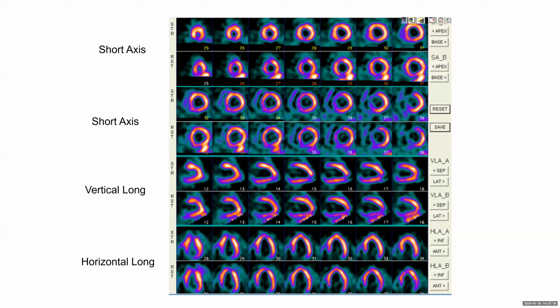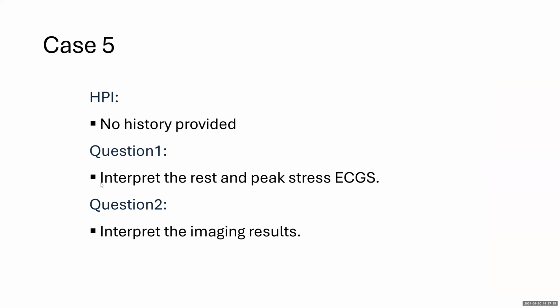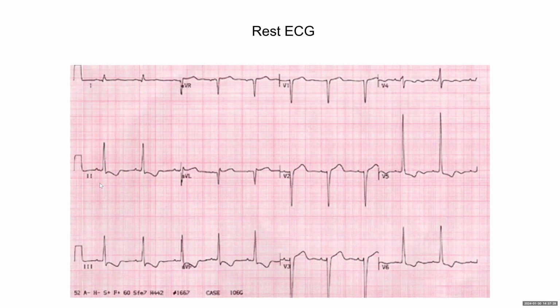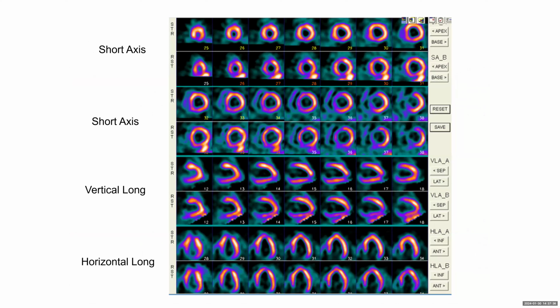From the beginning, the patient presented with dilated cardiomyopathy, so it's better to go for anatomic assessment rather than functional. Anatomy is important to rule out coronary artery disease in patients with LV systolic dysfunction, which is why it's actually recommended over ischemic or functional testing. Okay.